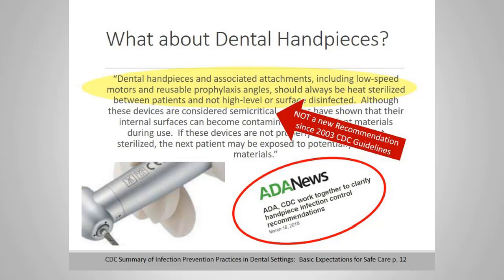If you have any questions or concerns at all, consult the CDC guidelines or the ADA website, and the statement in front of you is consistent with both agencies' stance on handpieces.